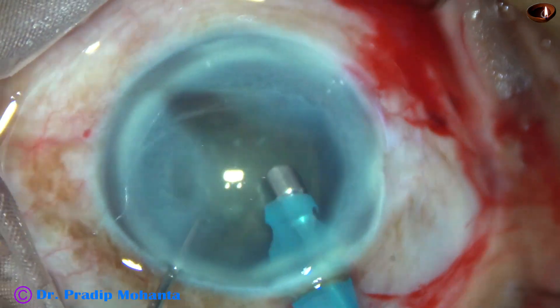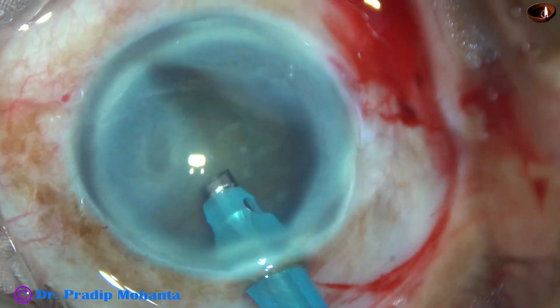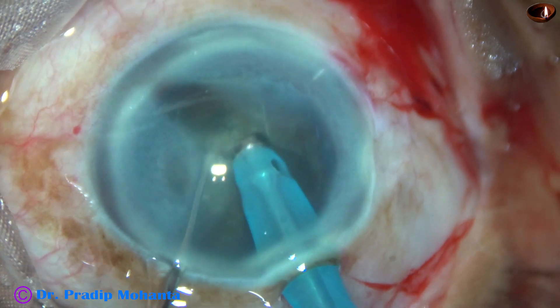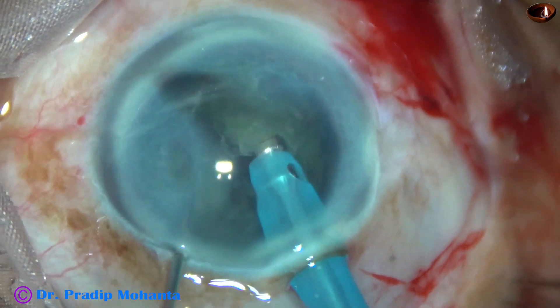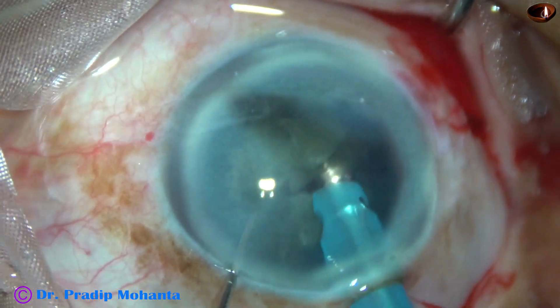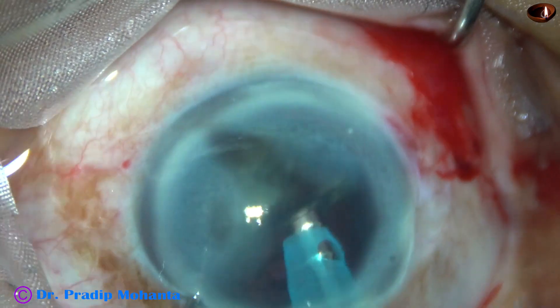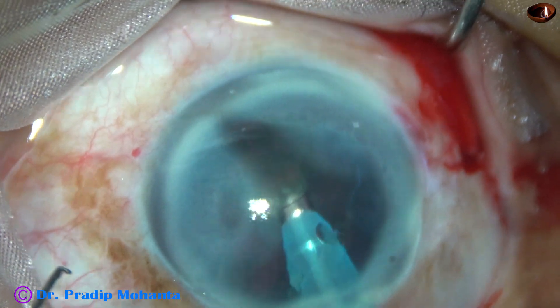Now some superficial lens matter is removed and then this is direct chop to divide the nucleus into several pieces. The nucleus is held firmly at the central area and the chopper is used to divide the nucleus. This free nuclear fragment is being emulsified. Though a large area of the cornea is opaque, there is a significant portion of the cornea which is clear and that is providing enough visibility to do the case quite comfortably.